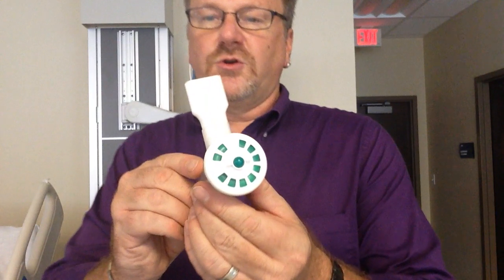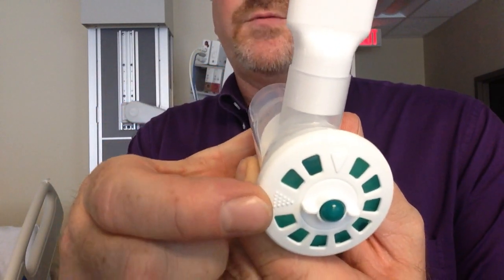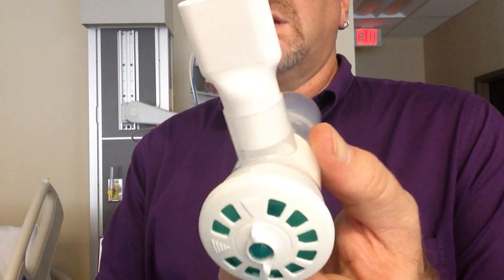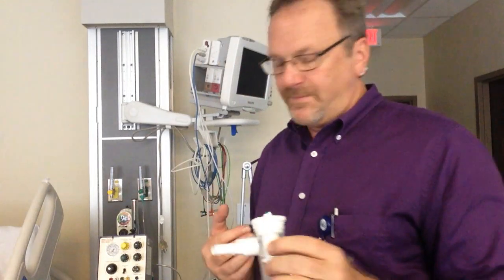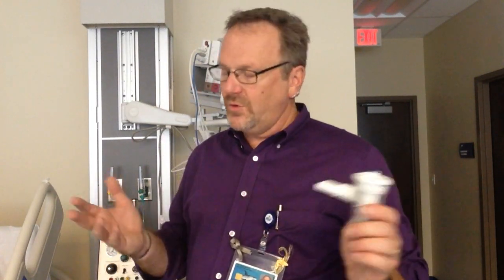With this, there are two ways of giving it. You see the dots, that is for breath actuated. If you twist it, that is for continuous, that is a solid triangle. So we want to give it, if at all possible, on breath actuated. It gives the patient the benefit. On breath actuated, it is a 5-minute treatment, and that is it. On the regular neb, you lose the benefit, of course, of breath actuated, and you're exposed to medication.